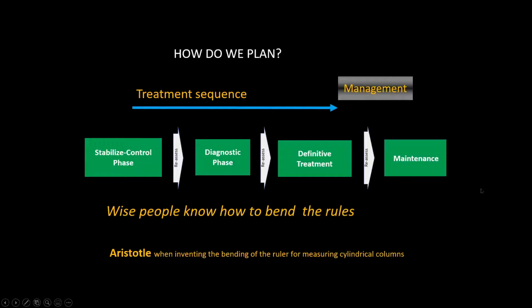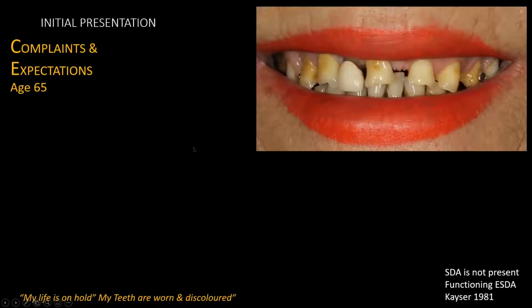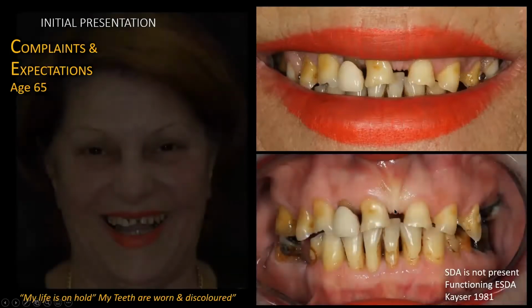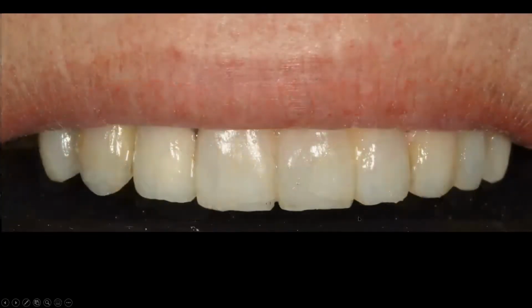So having said that, I come back to this particular patient, who presented at the age of 65. You've probably seen the slides before. When she was told that we can take your teeth out and put some implants everywhere, and given the cost, one guy quoted 40 grand, another 65, another 80, I said, look, I really don't understand, because we can really change this.